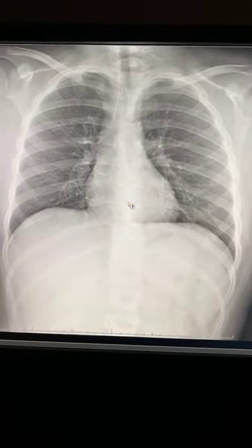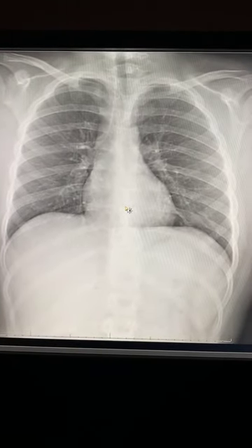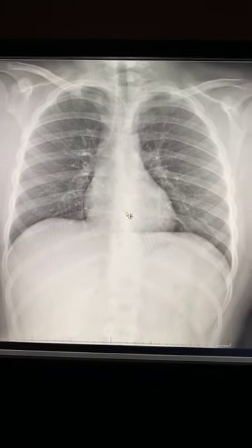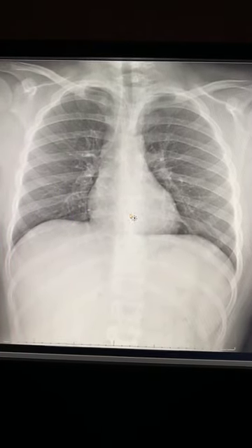So now I'm gonna say, okay, let's get straight down into the search pattern. If you're a surgeon, I have seen surgeons, they want to know select things and emergent things when a trauma patient comes in.